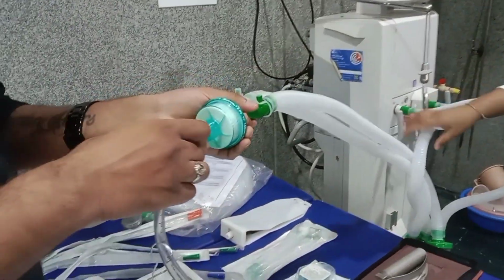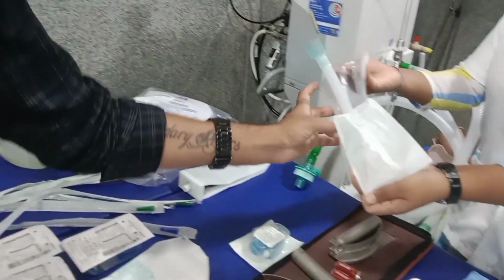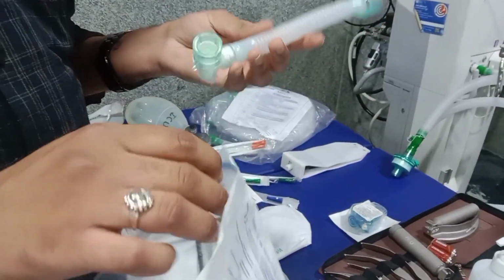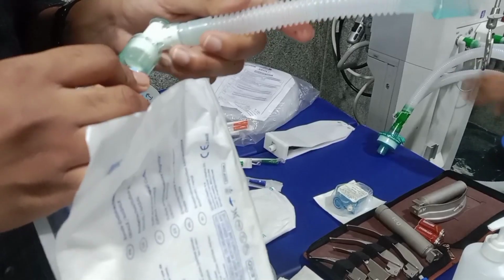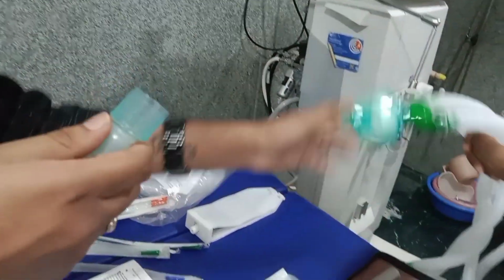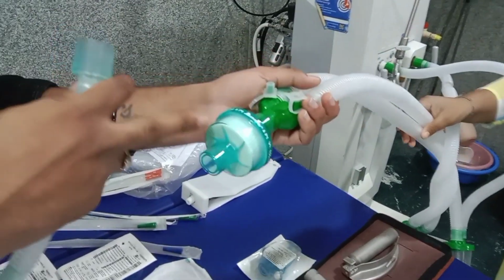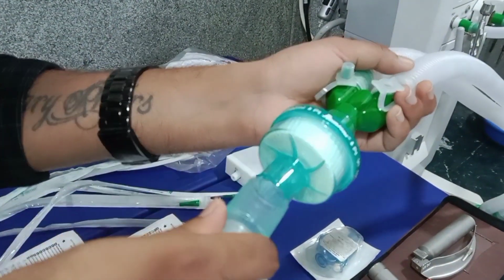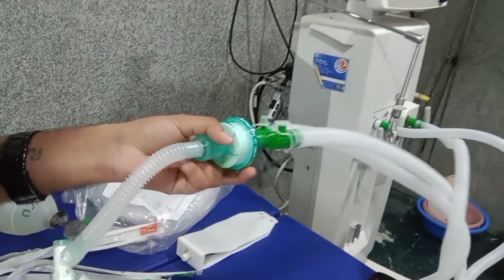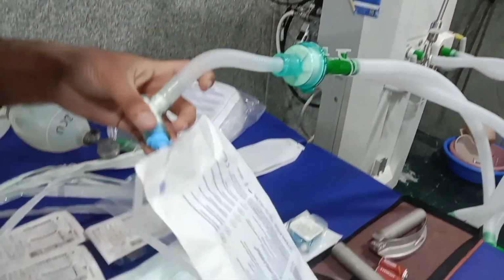So this circuit can be connected over the cath mount. Once the intubation is done, we connect the ETT to the cath mount here, and this cath mount is connected to the circuit, and the circuit should have a filter. We connect it like this, and we turn on the ventilator.